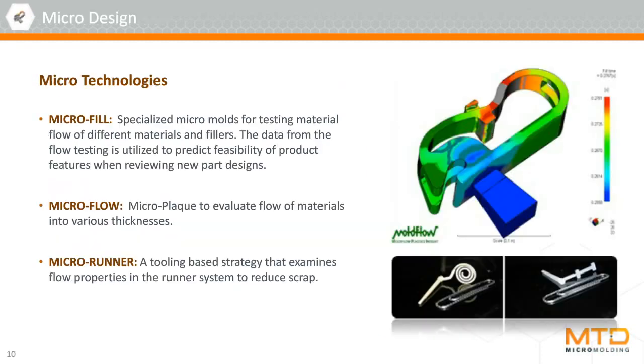The first step in the process is always focusing on the material and establishing what is required for material preparation pre-molding. Process development starts long before a customer's tool is ready and even before it starts being manufactured. A lot of bioabsorbable materials, exotic materials, and custom blends come to the door with minimal or no data, so we need to discover this for ourselves with testing.